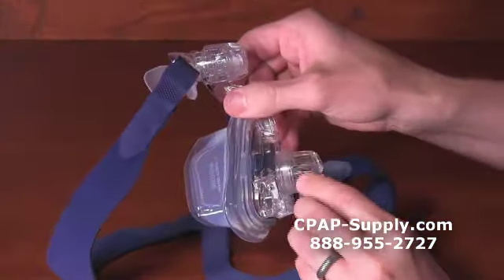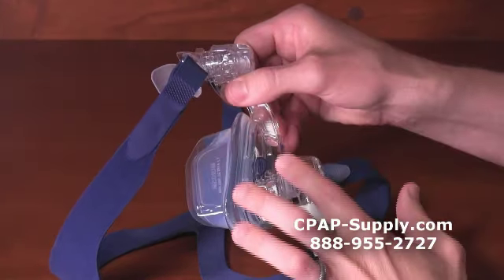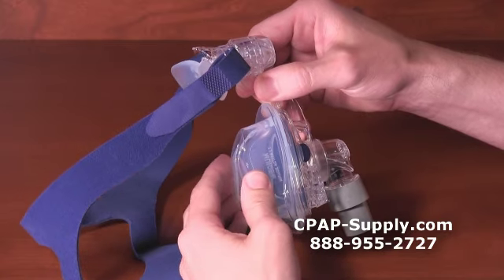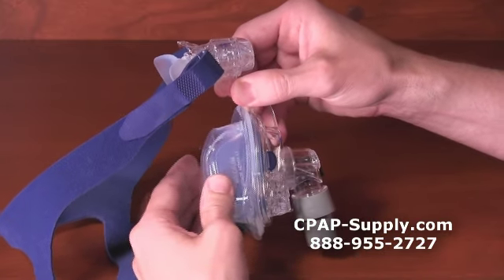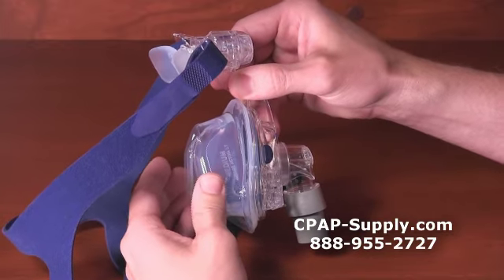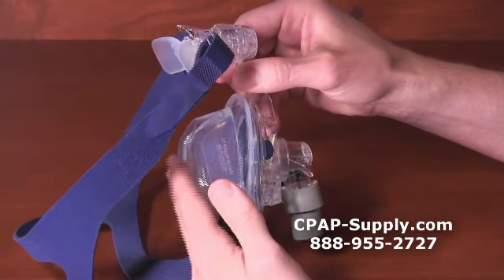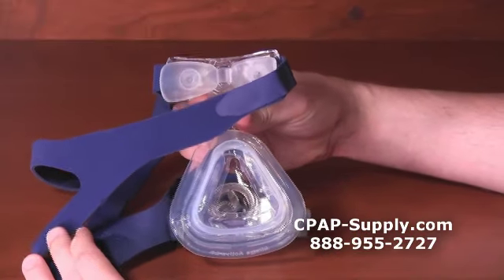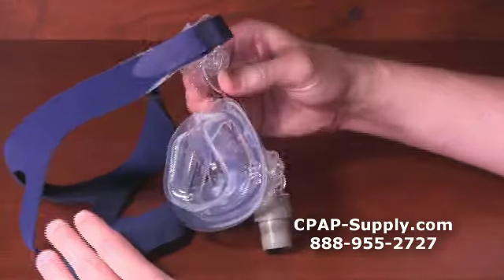The Activa LT and Softgel frames are identical. The included Activa LT cushion is designed specifically for active sleepers. The cushion flexes in and out, allowing the mask to maintain a good seal even when you're moving around. This cushion is designed to float on your face, so you'll wear this mask relatively loose so that the cushion can fully inflate with air to create a seal against your face.